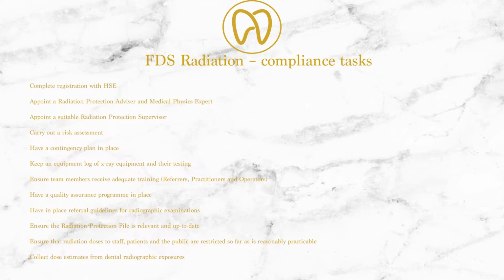We keep an equipment log in the radiation protection file, and this includes the annual testing as well as ongoing testing of the equipment throughout the year. All dentists who are taking x-rays perform the role of referrers, practitioners and operators, and they are trained during their CPD cycles. If you update your training, please send a copy of this to the practice manager so this can be added to your file.